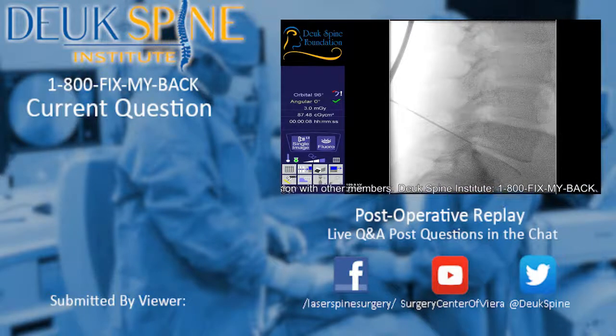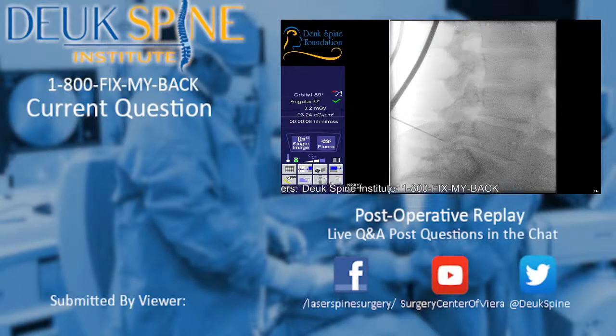I tried to get underneath it and pull it down as much as I could. I used a lot of different tools and techniques. You saw me use the Grabzilla. We used the standard pituitary. We used the laser. I went for a lateral approach, really far lateral entry point, and aimed more medial.